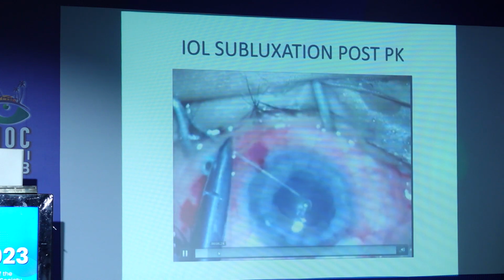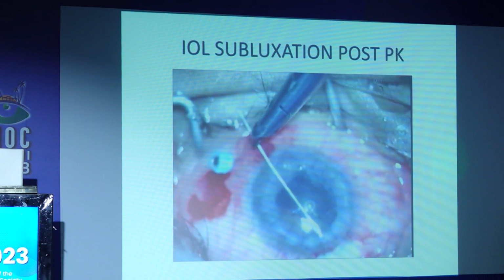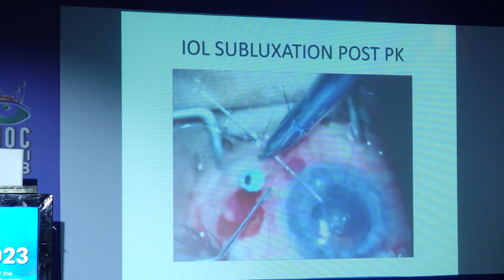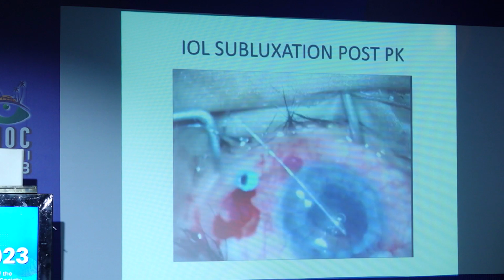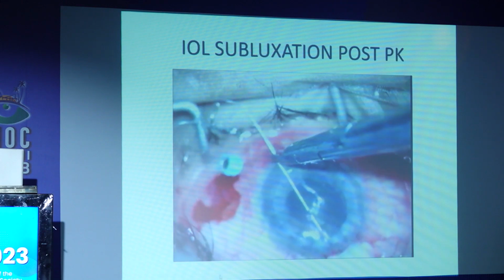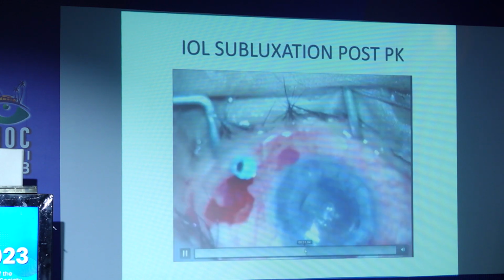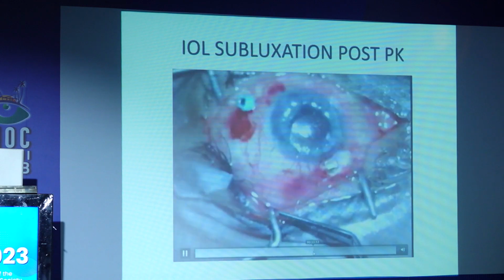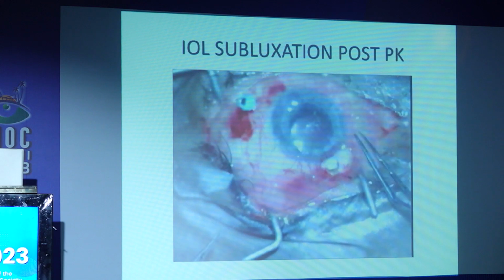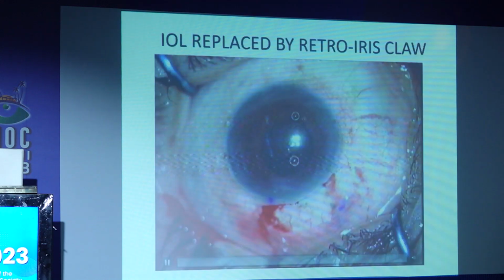So I did a small sclerotomy. I'm just entangling the hook between the two loops of the 10-0 Prolene and then fixing that IOL on the sclera. You see now a nicely fixed IOL, so without removing the IOL, without causing any damage to the cornea, you can still fix these IOLs very well.